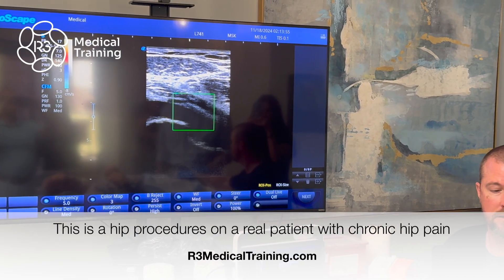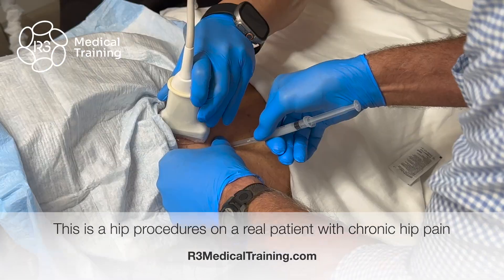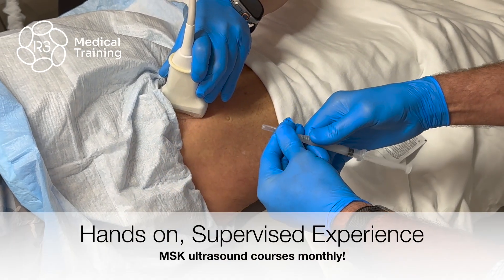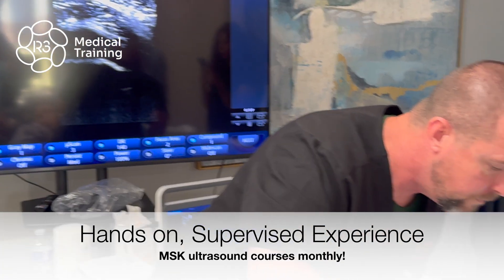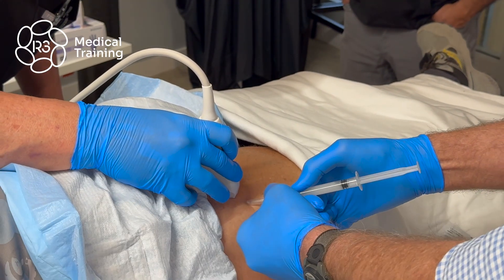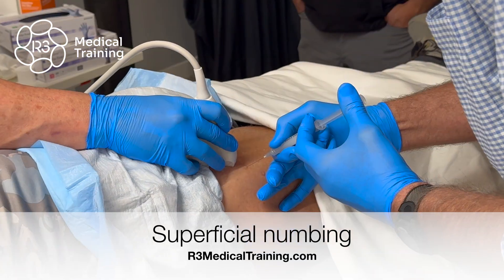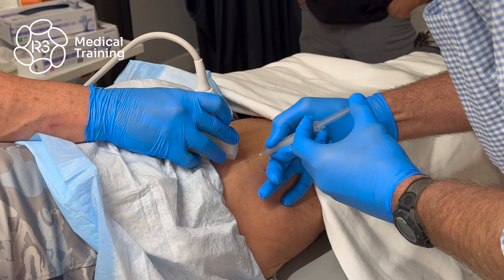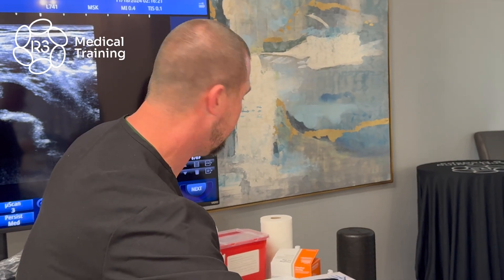Anywhere into that black — this is just a marker, no needle. We're just going to numb around there. Come a little back off it, right there. This is going to be steeper, about a 45-degree angle. We don't have a whole lot of sensory information much more down below the skin, so I don't have to worry about numbing up the whole track. Right in that black space.